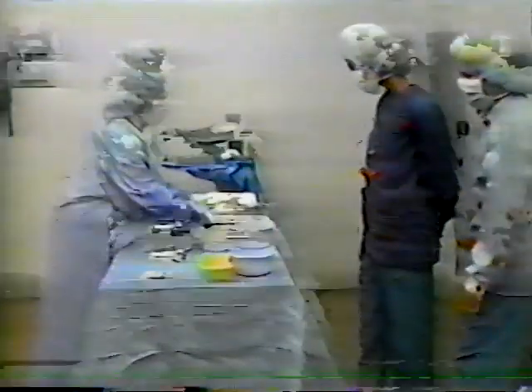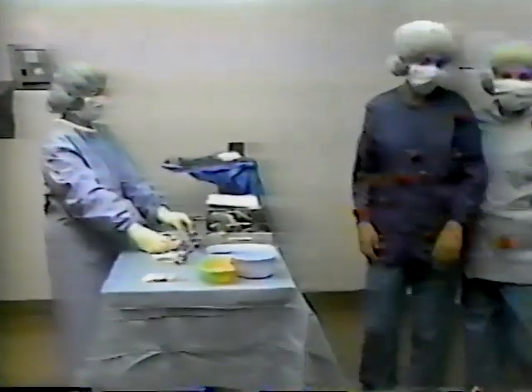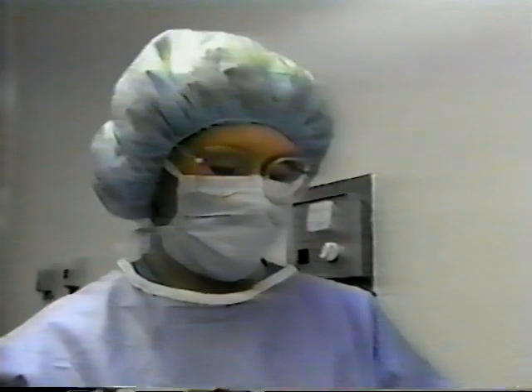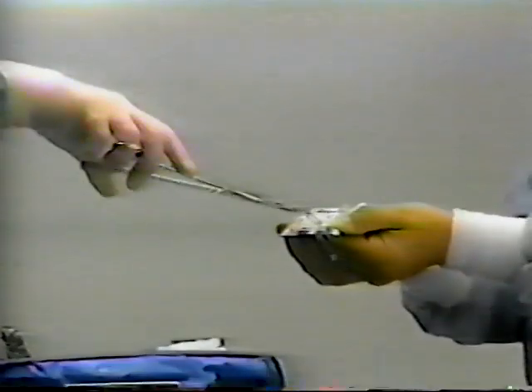Unsterile persons should not lean or reach over sterile areas and should always maintain a distance of safety to prevent accidental contamination. A safety margin must be maintained, either by space or by using an instrument for extension.